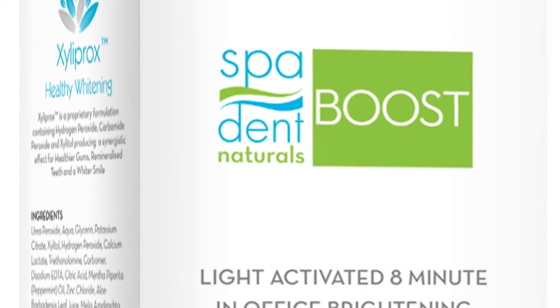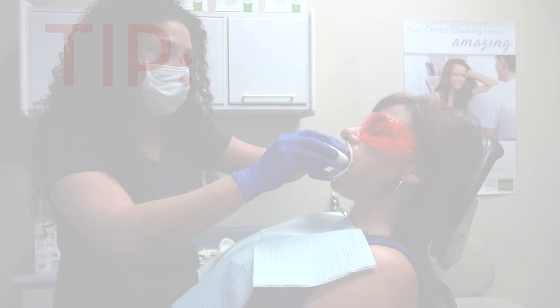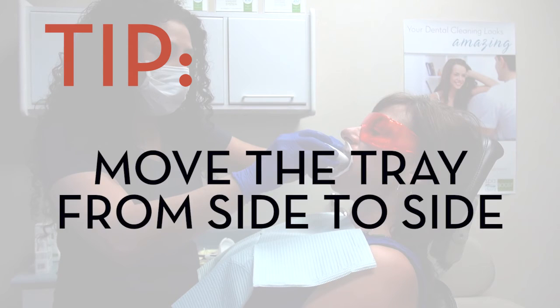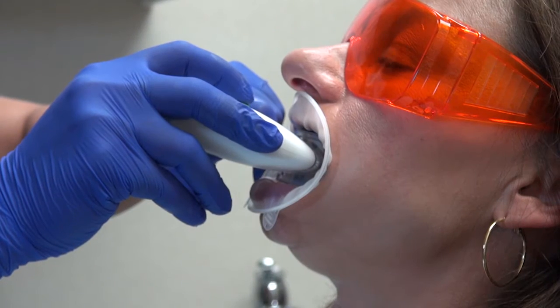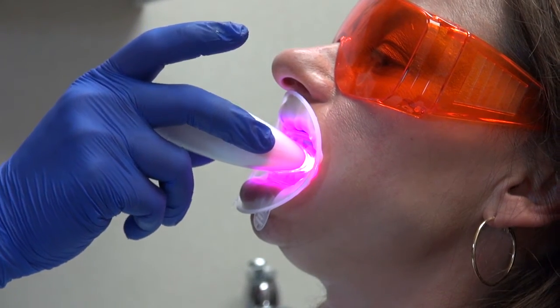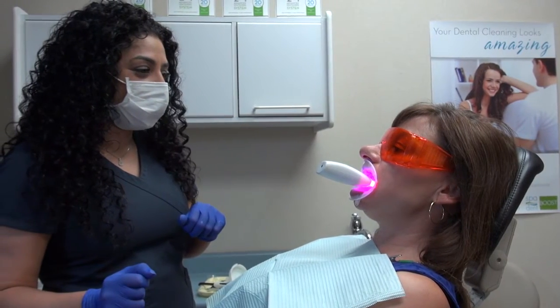Begin the boost whitening session by inserting the tray into your patient's mouth. Make sure you don't push it against the teeth because this can cause the gel to overflow onto the gums. Gently move the tray from side to side, ensuring the gel is evenly distributed. Turn the whitening pod on. Make sure the patient remains in a slightly reclined position and the tray is in contact with their teeth throughout the application.